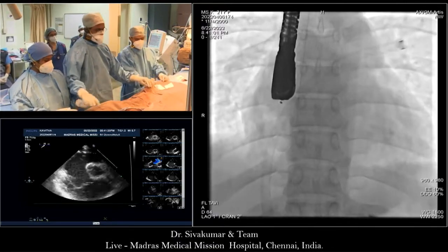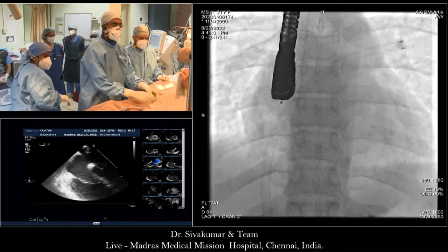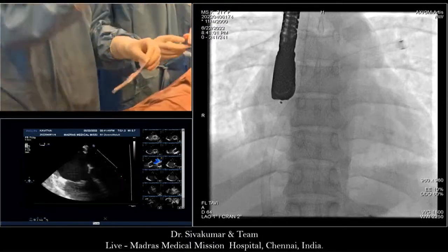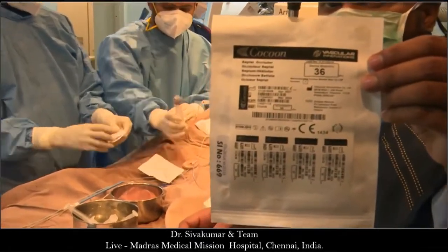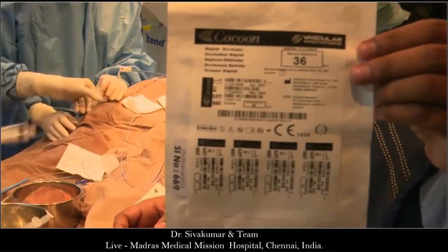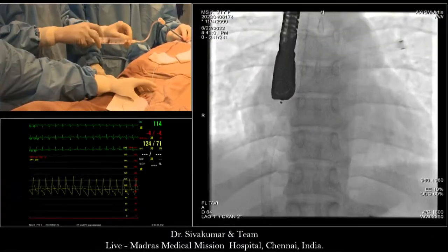So two numbers. What, 36 Cocoon? I'm completely okay with 36 next. Okay, show the device. Give the device to me. So can we get the audience today? 34, hands up. Show the device. 36, hands up. 38, hands up. Okay, 36. Oh, there you go. He's showing 36. Okay. Siva, just make sure you're not listening to us stupid people. Just keep on looking after the patient, okay?